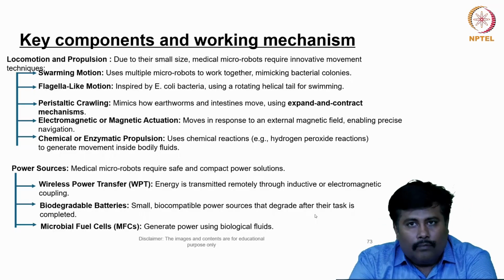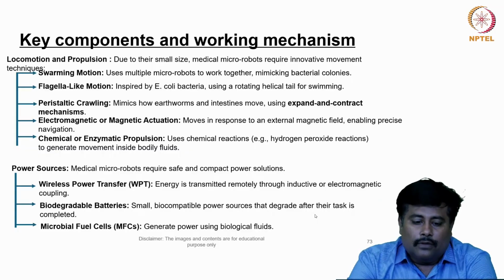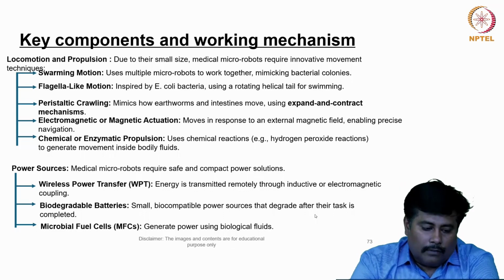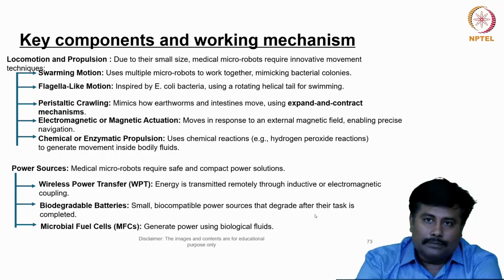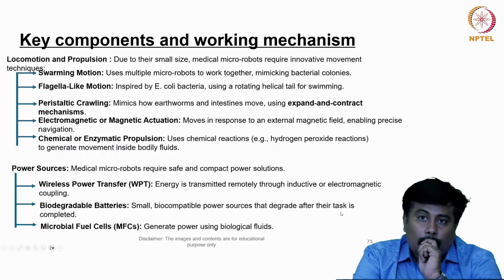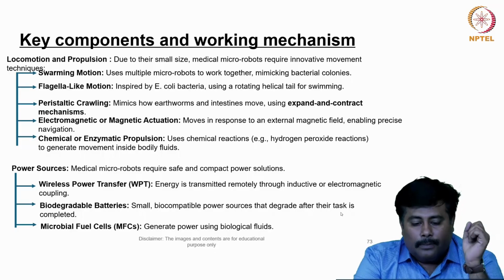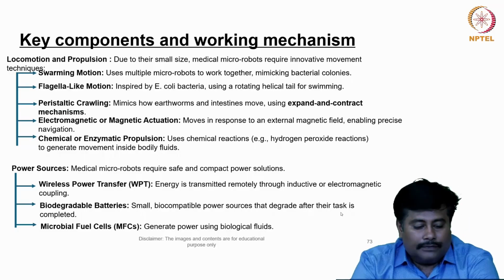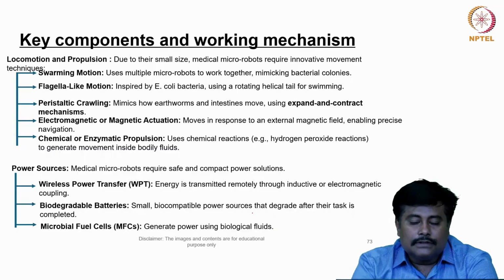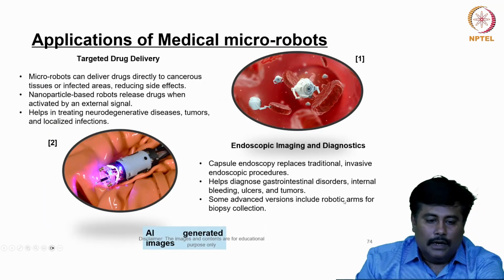Now from the power source point of view, these medical micro robots require safe and compact power solutions. One aspect is wireless power transfer, where energy is transmitted remotely through inductive or electromagnetic coupling. Biodegradable batteries are small biocompatible power sources that degrade after their task is completed. Fuel cells, such as microbial fuel cells, generate power using a biological fluid.